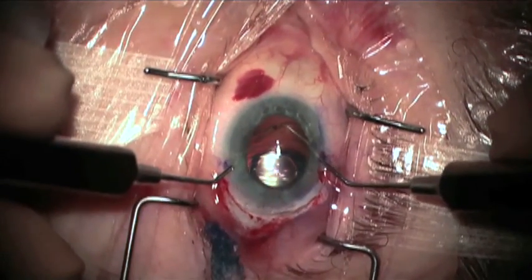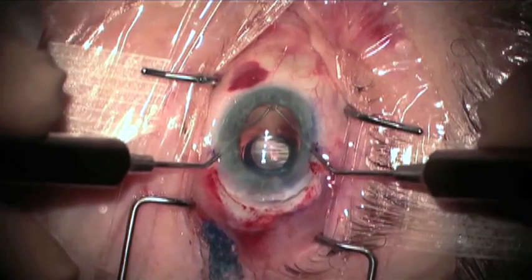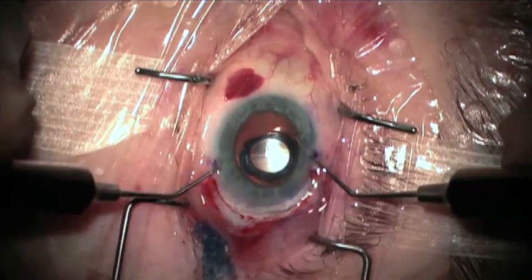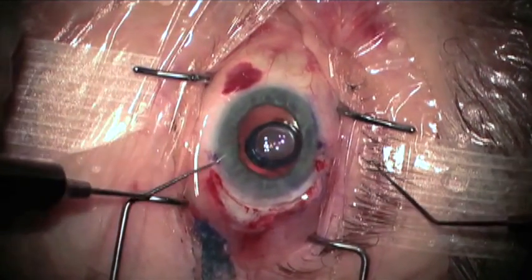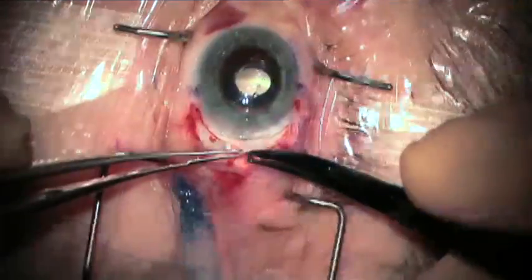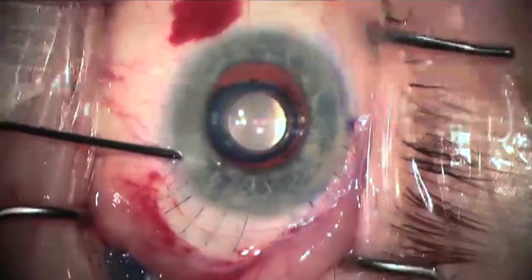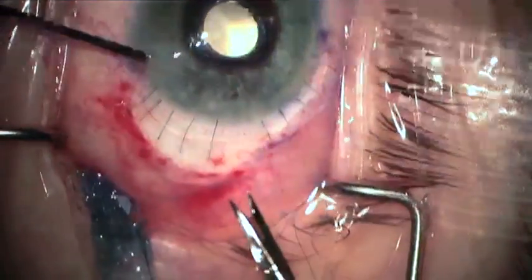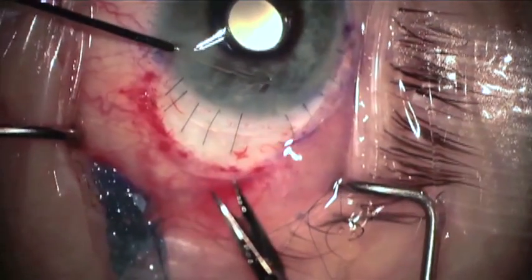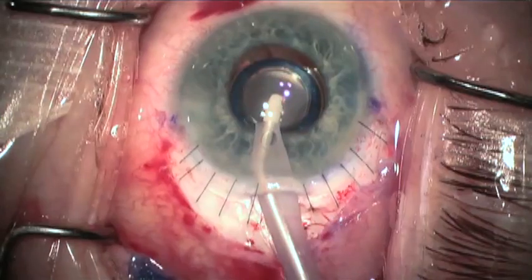Here two Sinskey hooks are used — one to compress the loop and the fellow in the eyelet — to get it under the capsule bag that has been stained by Trypan Blue. The optic is noted to center well, and following this, the incision is closed with interrupted multiple 10-0 nylon sutures, and a sub-incisional iridotomy is fashioned with scissors.